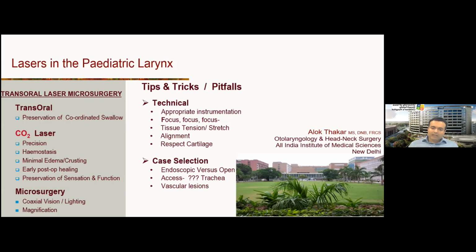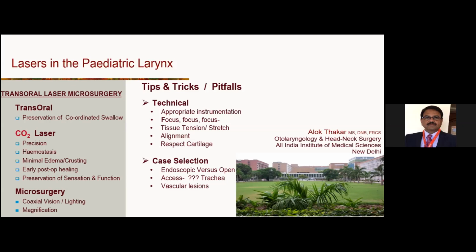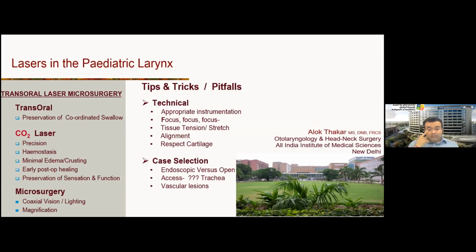So if you're ever using lasers, and if you have the laser which has the ultra pulse, use that mode. That is the best mode you're going to use in any airway surgery, leave apart pediatric airway. And even in the ultra pulse mode, the settings matter a lot. One of the things you want to avoid while using laser in the pediatric airway is what we call the carbonization effect, in any airway surgery for that sake. What that entails is you're hitting the same region again and again and again and producing charring around that area. That happens if you don't have a very sharp, powerful laser.